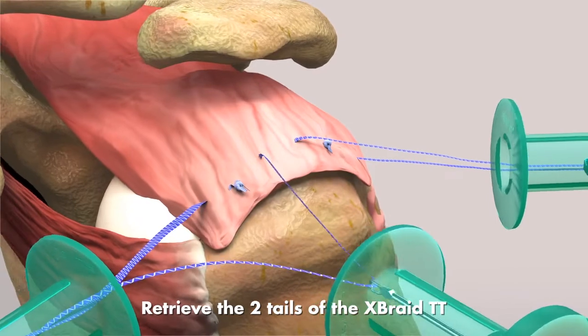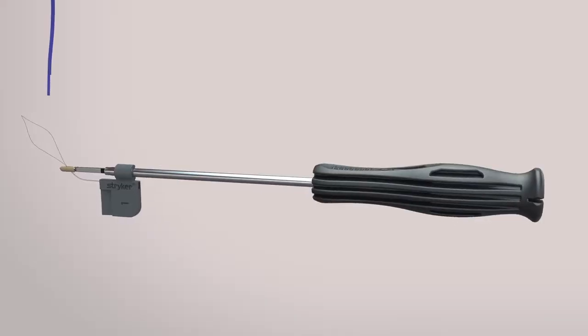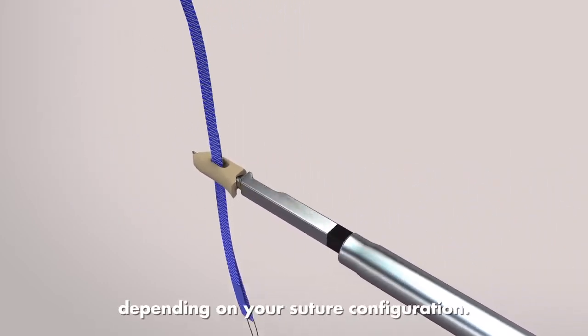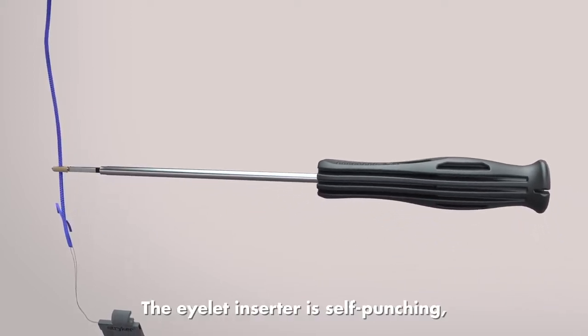Retrieve the two tails of the X-Braid TT into the eyelet using the pull tab. Note, up to eight tails of No. 2 force fiber can be loaded through the eyelet depending on your suture configuration.